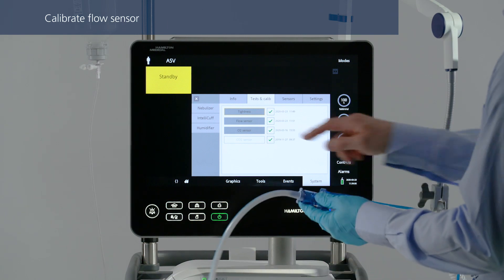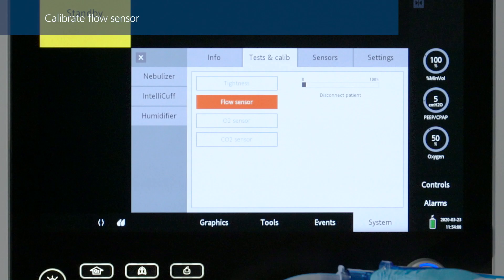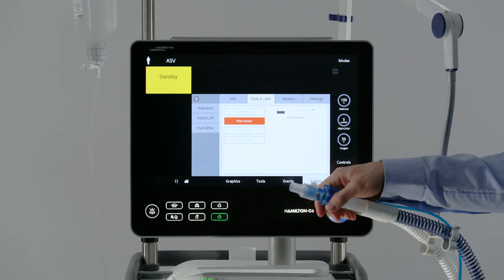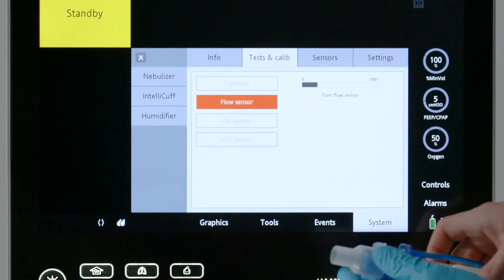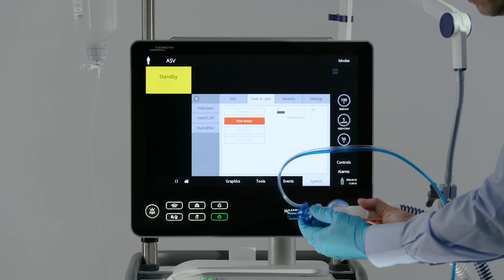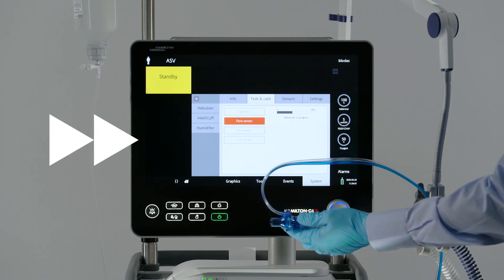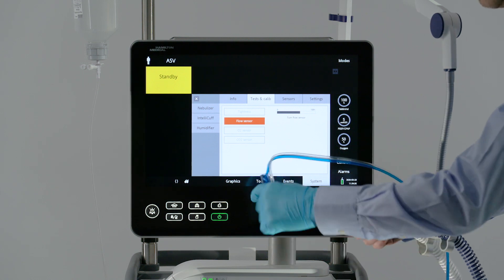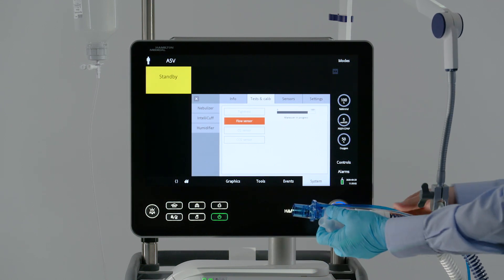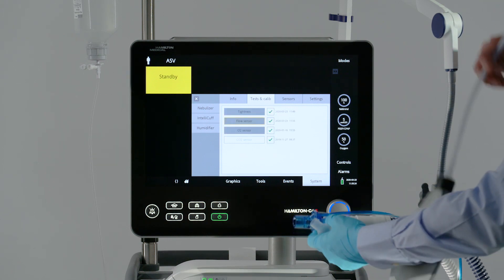To calibrate the flow sensor, select the desired operation, then follow the instructions from the ventilator. When the 'Disconnect Patient' message appears, disconnect the test lung and attach the adapter to the flow sensor. When the message 'Turn the flow sensor' appears, flip the flow sensor. Wait, and then flip the flow sensor back to its starting position. Disconnect the adapter from the flow sensor. When calibration has been completed successfully, a green check mark will appear.